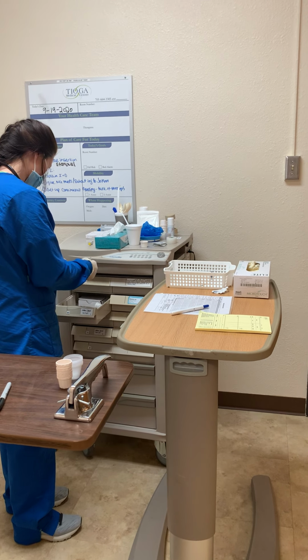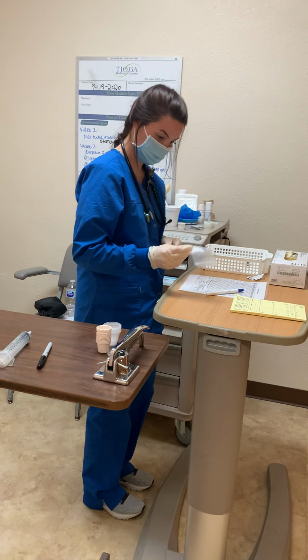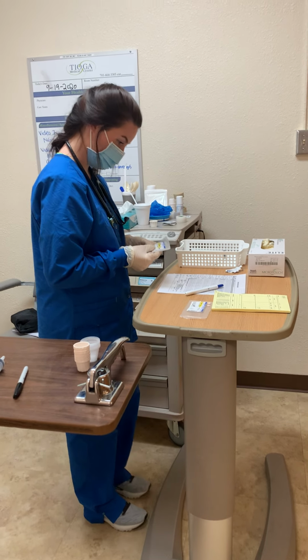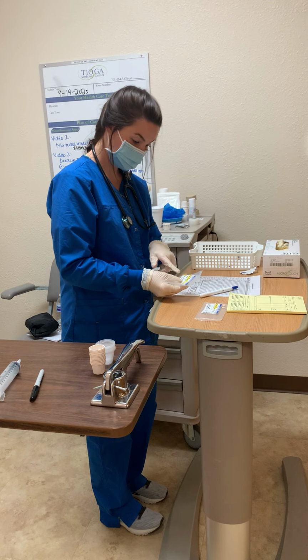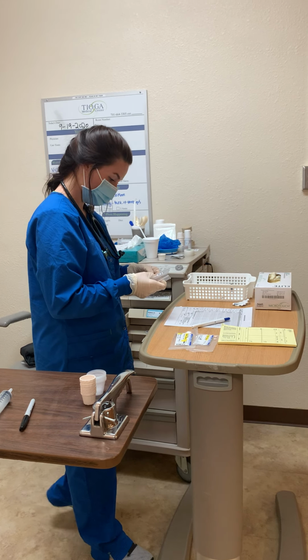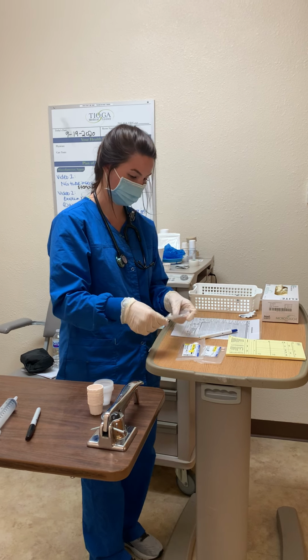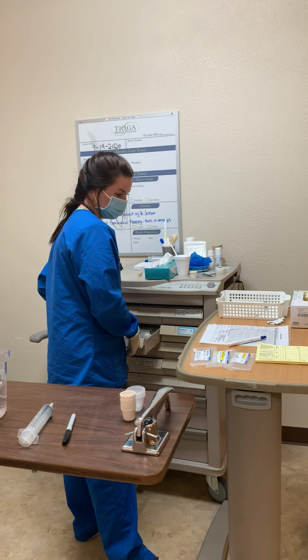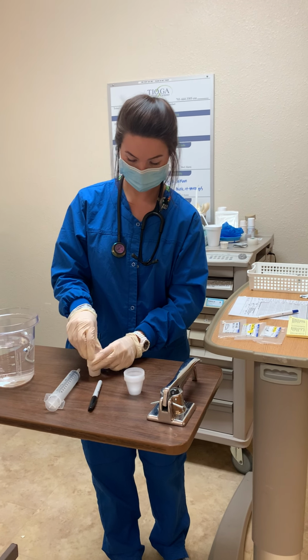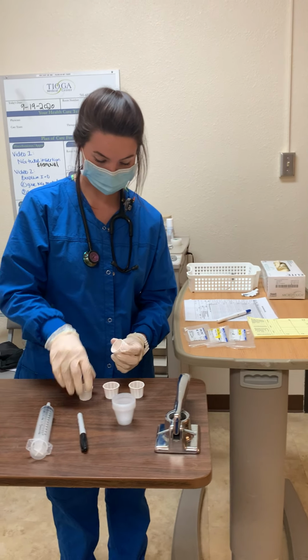So this is our Lasix, and that is 20 milligrams, which matches our medication there, 20 milligrams. Acetaminophen, 500 milligrams, 500 milligrams, so that's what we have here. And then we also have aspirin, which is 81 milligrams, which matches the bag I have here. So those are my 3 medications that Joanne's going to get. And we're just going to go ahead and crush them to start. So I'd want to label each one of my cups so I didn't mix up any of my medications.